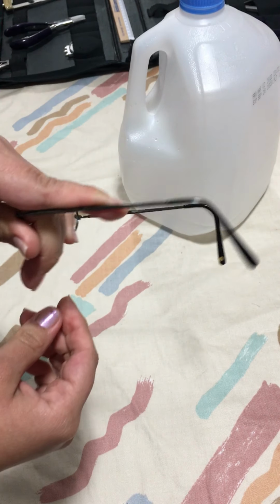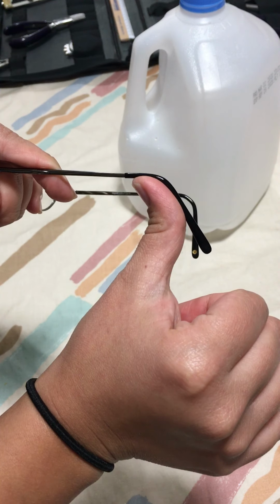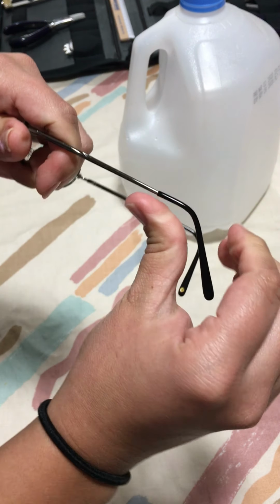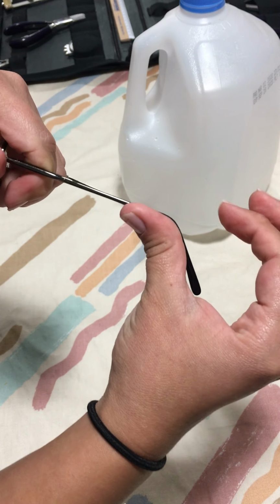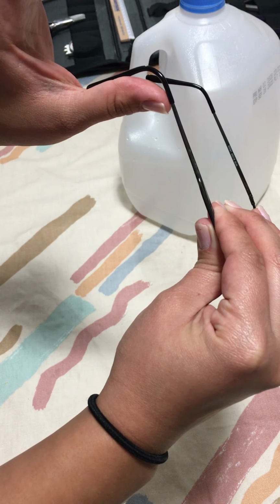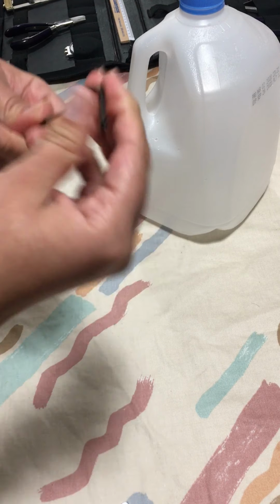See, now it looks a lot better. It has a 45 angle, and if I put my finger, it has a little bit more. So I'm gonna do a little bit more right here, and now it's good. See, there's no space between the finger and the temple bend. Again, I am gonna do the same thing here. So I'm gonna stretch it out using my fingers as my tool.